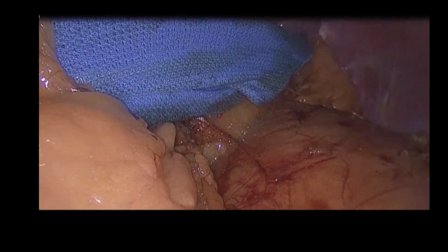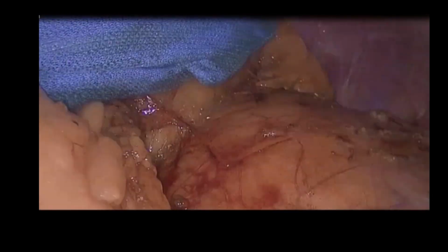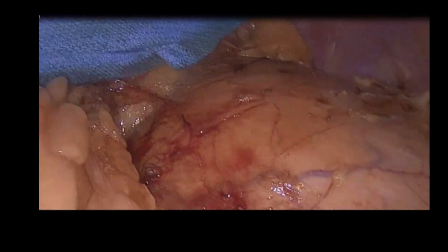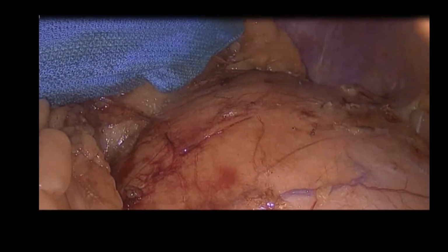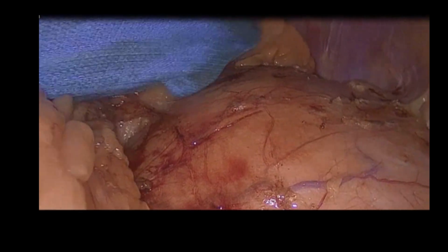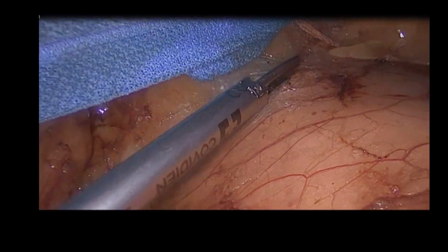When I'm working more superiorly, I tend to have the paddle opened up quite a bit more. When I'm working more inferiorly near the hilum, because of where the port placement is for the paddle retractor, I roll it in and have it less fully deployed to allow me to work in a certain spot. You can also switch instruments around and change the port through which the paddle retractor comes in.